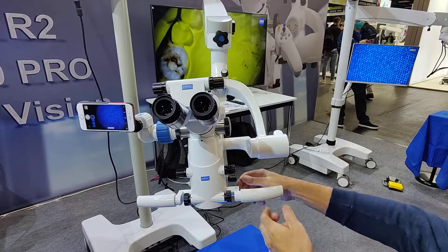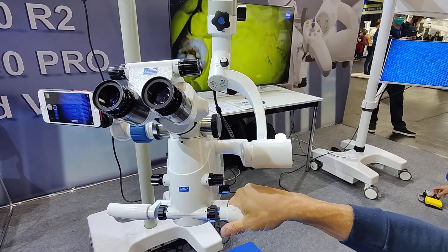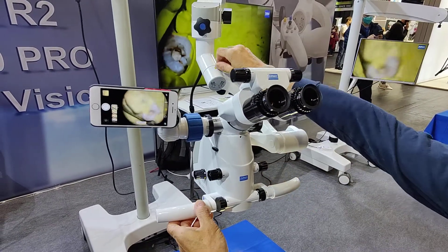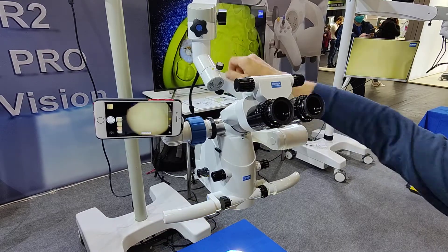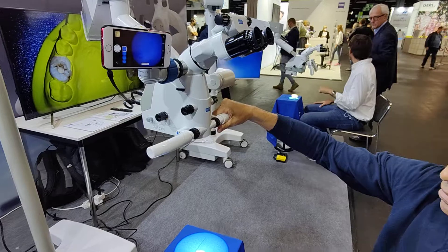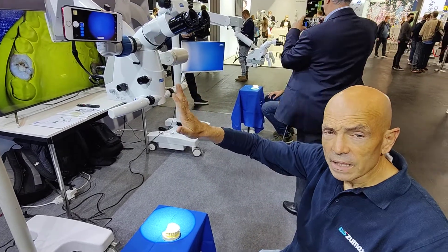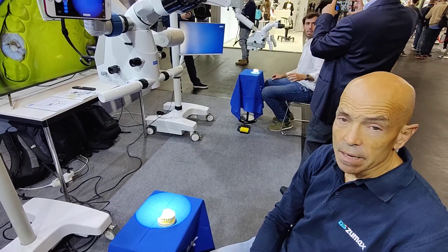On this side we have the adjustment of the light intensity, and then we have the knob for adjusting the friction for the arms. We also have increased light power on this new model, and I think that's it.